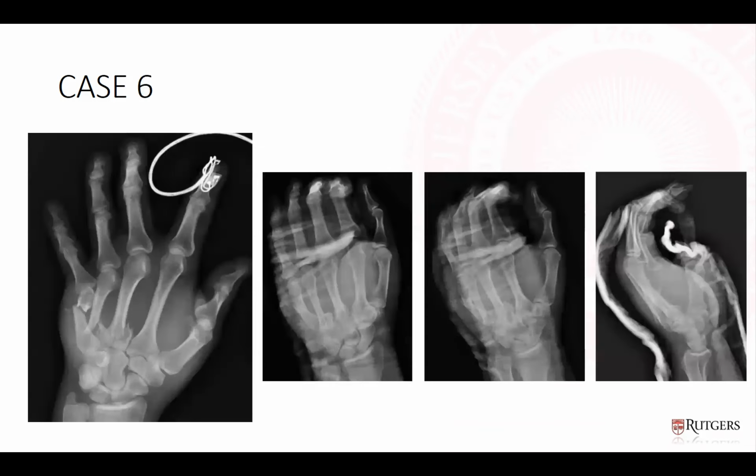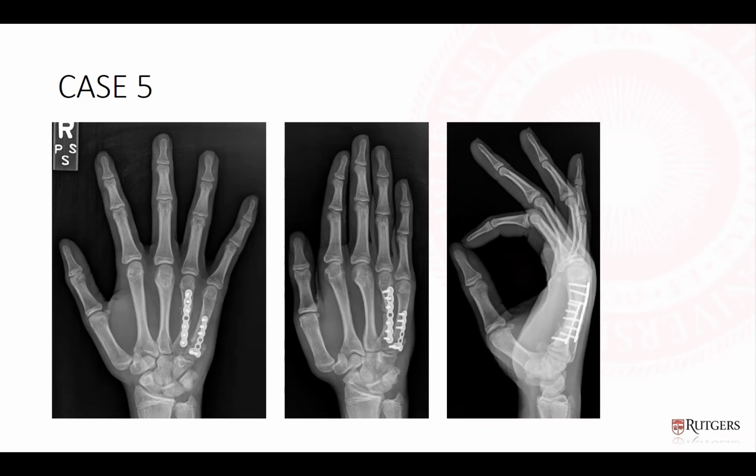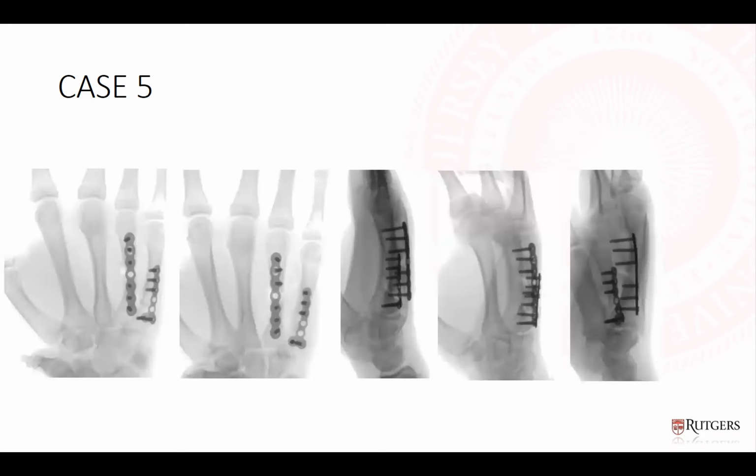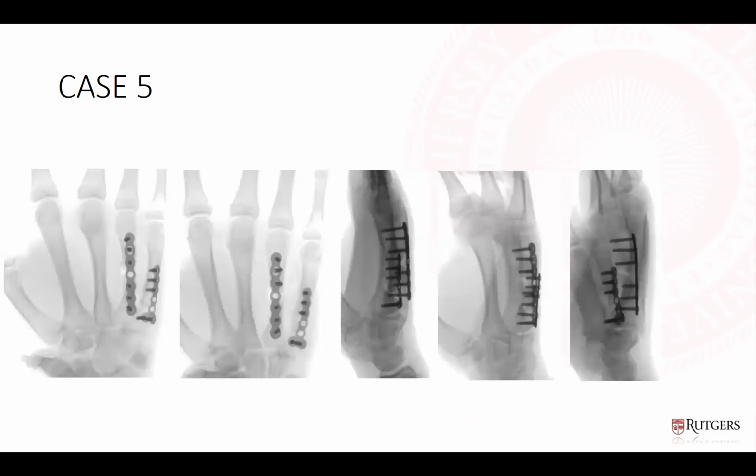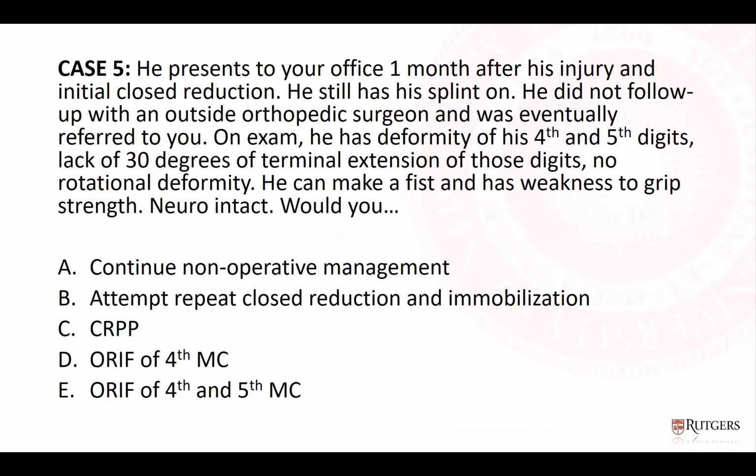So you did this for a bump, right? Say that again? It was healed. You showed an x-ray with callus. It was definitely not aligned properly. Correct. This was more of an aesthetic. Did he have any functional problem, or was it just he didn't like the bump? He did have some stiffness per the note. He had an extensor lag. This is my case. I'm sorry, 30 degrees of extensor lag.